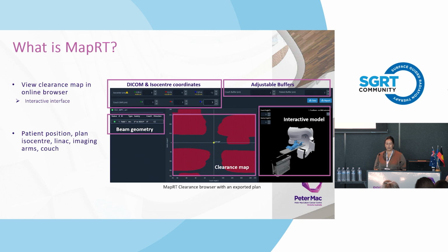So the clearance program is a web browser based one, so our planners can log in from their own computers, which is great. And the interface is also very interactive, as it shows you the patient's position, isocenter coordinates, imaging arms, couch positions, basically anything you need to do a clearance assessment. And also all of these aspects can be adjusted in the program of the clearance map, and it will update itself as you're changing it.